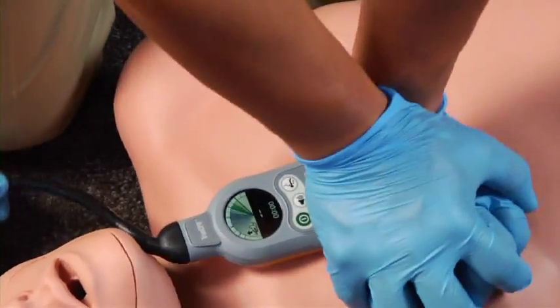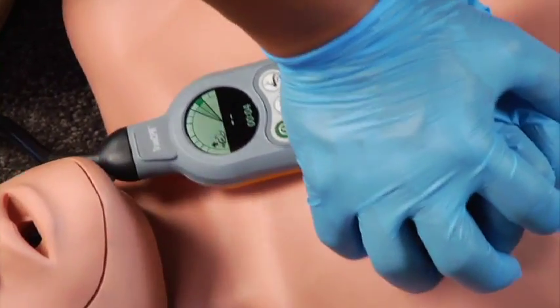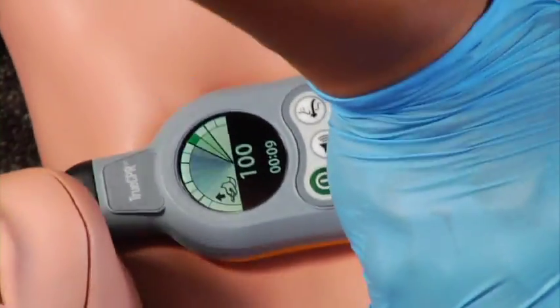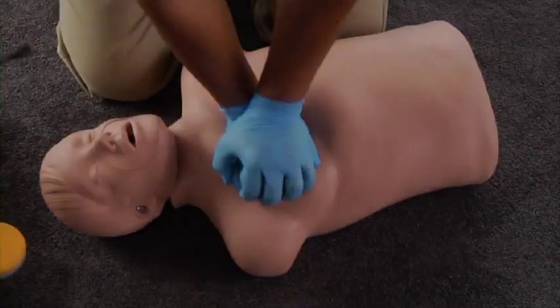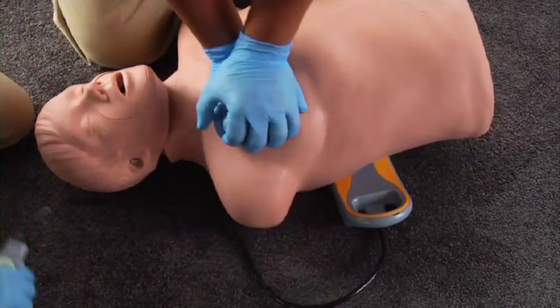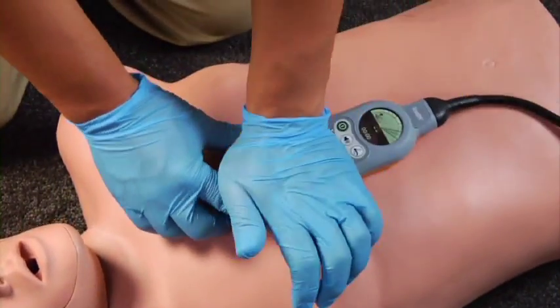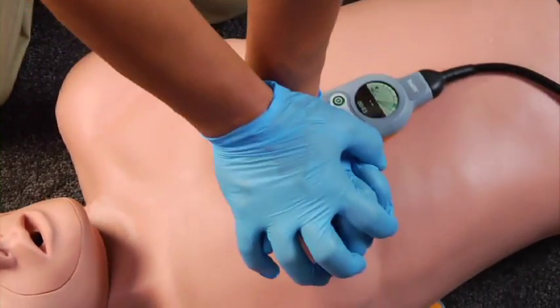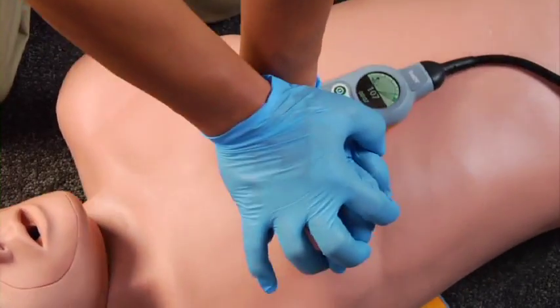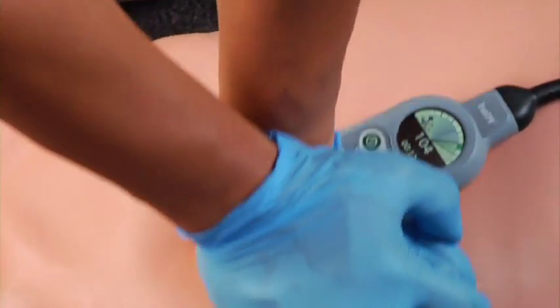Put the heel of your hand on the palm pad and start compressions in time with the metronome. If the device can't be placed in the recommended position, an alternative is the side position, like this. Either side is okay for the back pad, but in the side position you have to turn the chest pad around, like this. Always keep the palm pad in the middle of the chest on the lower half of the sternum. If the device cannot be positioned properly, perform CPR unaided.